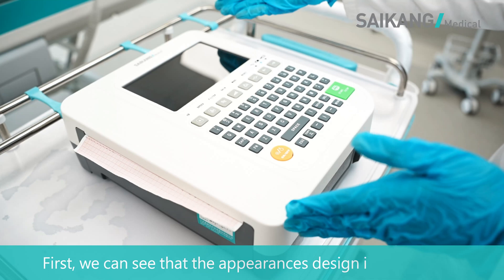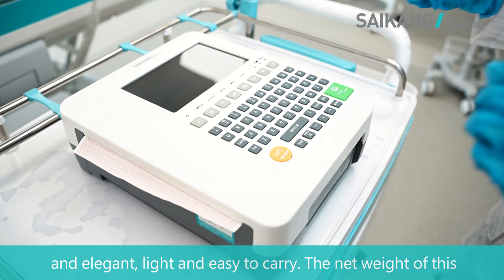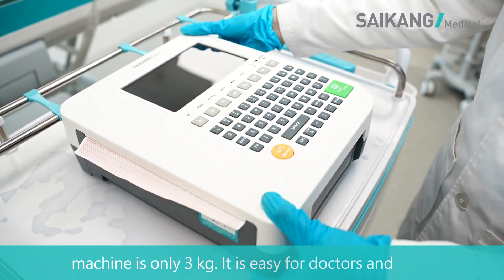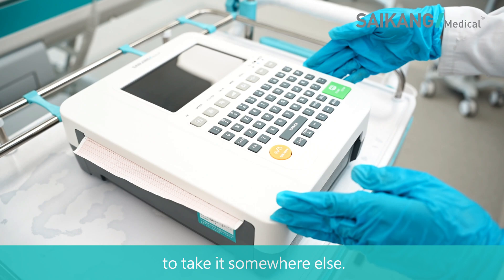First, we can see that the appearance design is very simple and elegant. Light and easy to carry — the weight of this machine is only 3 kg. It is easy for doctors and nurses to take it somewhere else.